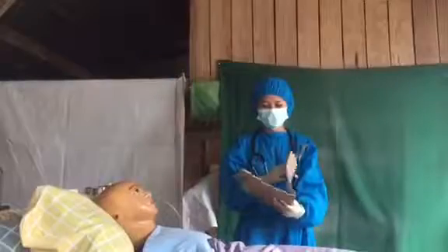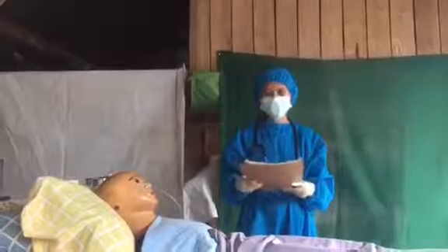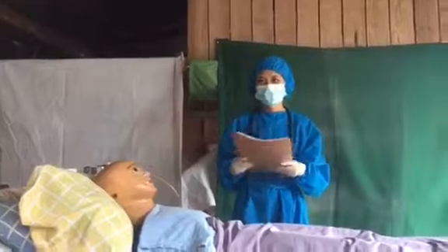And after that, record the patient's data, time and date, the procedure being done, and the reaction of the patient during and after the procedure. So that's how to insert an NGT to the patient.